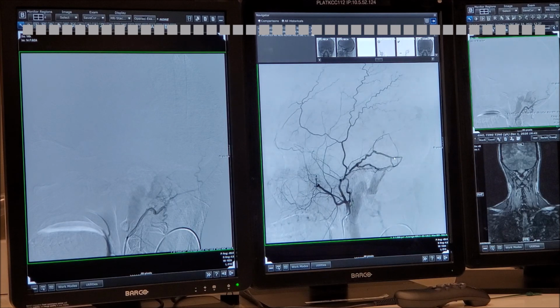But what are you going to use? So I have to take down the point of the fistula. I want something that can depend on where I position my catheter. If I'm close enough, I can use glue because that's more adhesive. You could use diluted glue. But I would say for dural fistulas today, DMSO-based agents are far better, because you have the ability to inject, stop, inject.